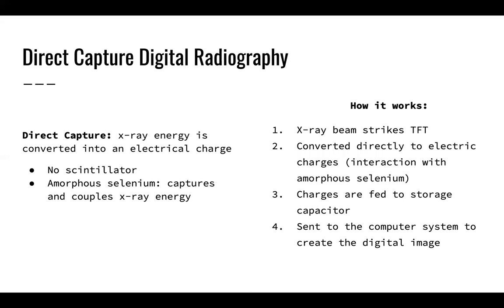The amorphous selenium captures and couples X-ray energy. Then the electrical charges are collected by a storage capacitor, which is then sent off and forms a digital image.